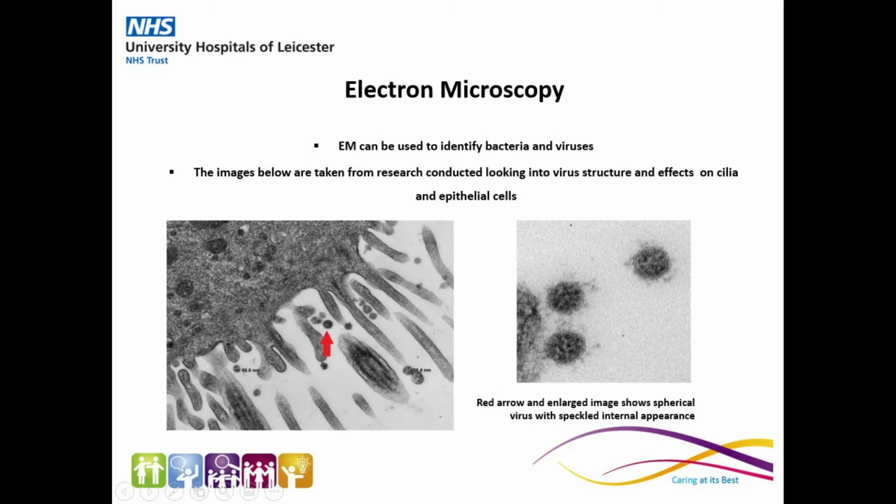These images shown are taken from the study, and the structures seen are consistent with images of virus reported in journals around the world.